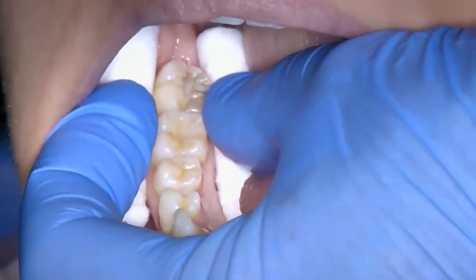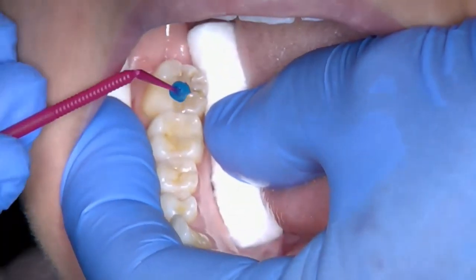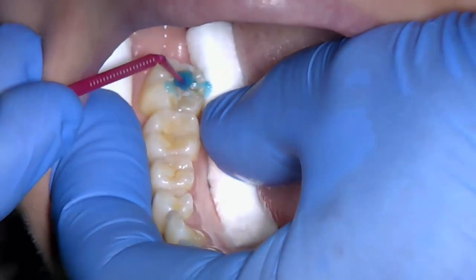37% phosphoric acid etch is applied to the fissures using a micro brush, trying to keep the etch confined to the fissure pattern. The etch is left on for 15 seconds before washing off with the 3-in-1 syringe.